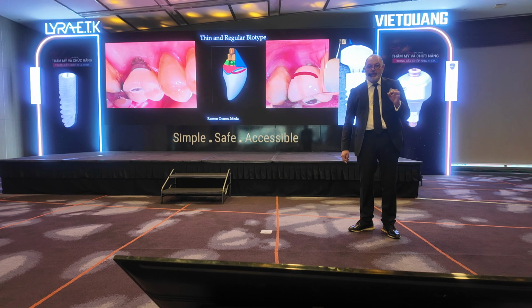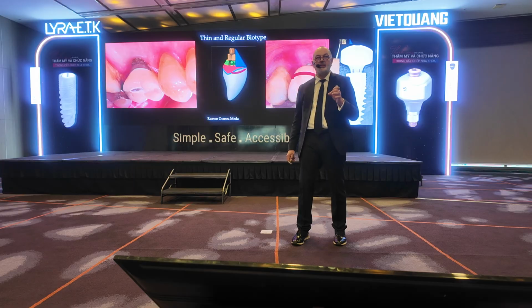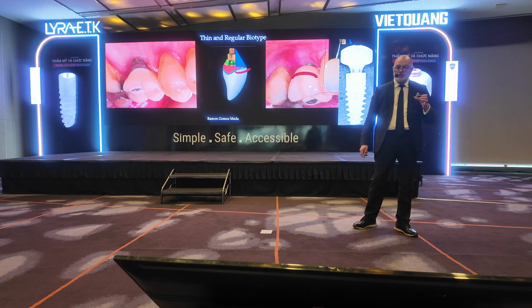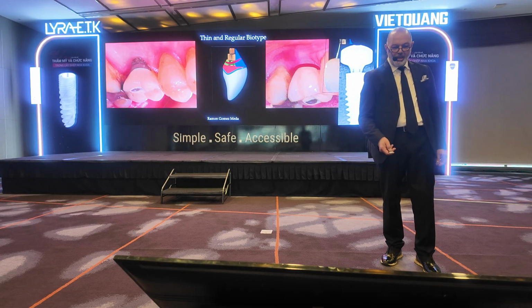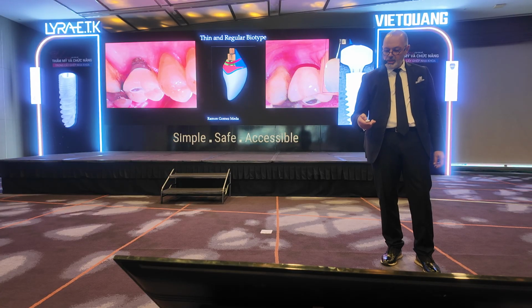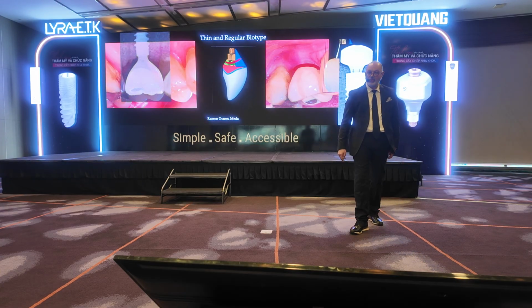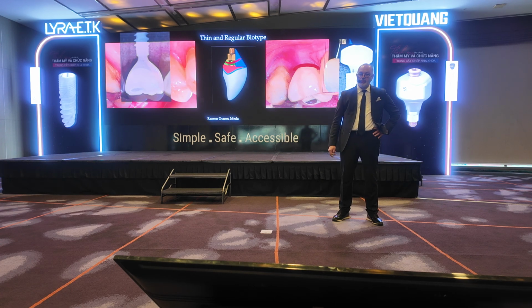The emergence angle is the difference between the diameter of the implant and the outer diameter of the crown. That's why in this kind of case, we had the gingiva in the beginning here. And with time, everything goes down with this recession because of this angulation. And this angulation is too aggressive. That's why we have this kind of recession with time.